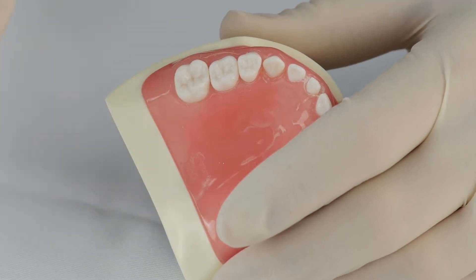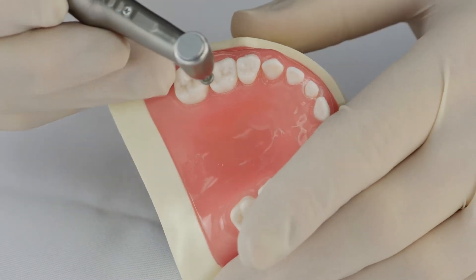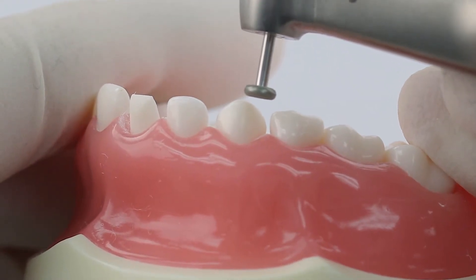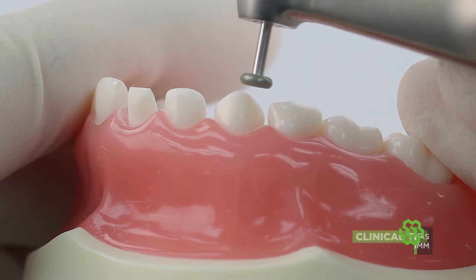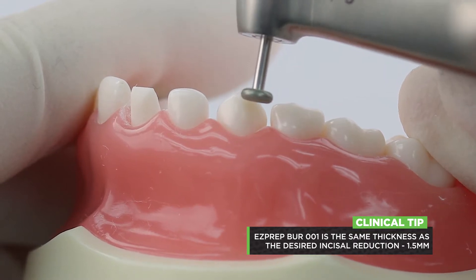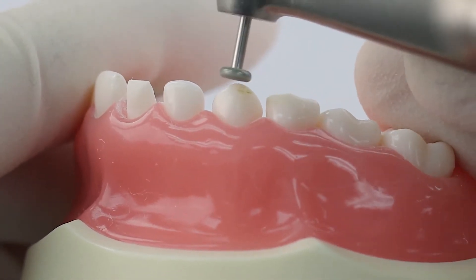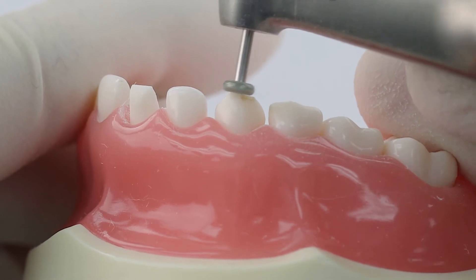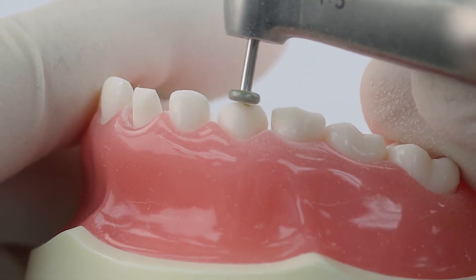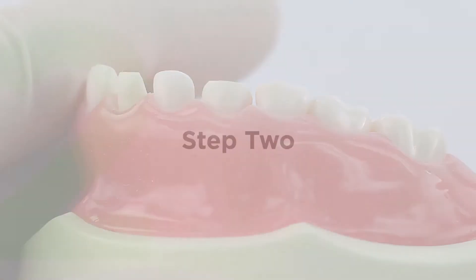We're going to do cuspid prep. Cuspid prep is very similar to the incisor prep, with a couple of exceptions. We're going to do millimeter and half incisal reduction. Use this burr as your depth guide. Drop it down so the tip of the tooth lines up with the top of the burr, make a notch, then go in and take off the tip until that mark disappears. And that's the incisal reduction.